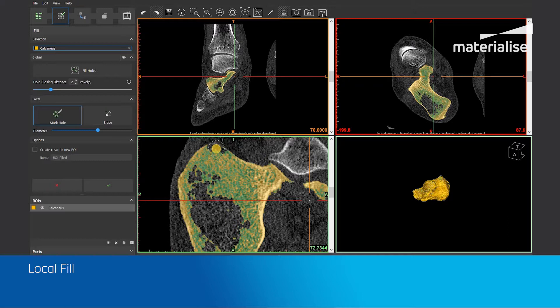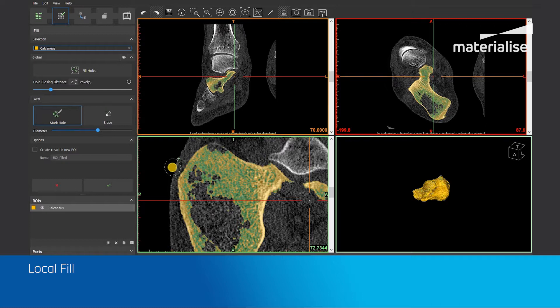The local fill can only be used on the 2D images. When the mark hole option of the local fill is selected, you will see that your cursor now has two circles: one solid inner circle and one dotted outer circle. The solid inner circle will always fill when you brush. The dotted outer circle will see whether it can close a hole and then fill it. Basically, it's like magic.